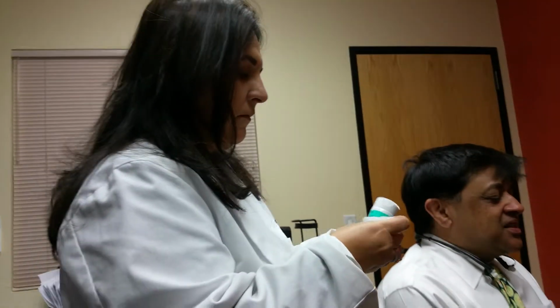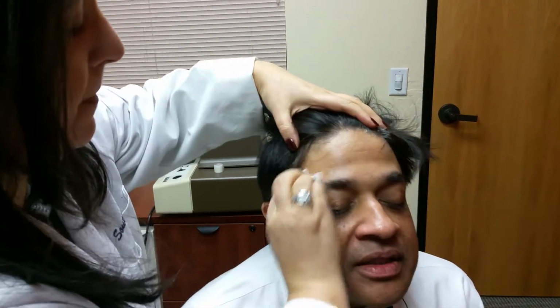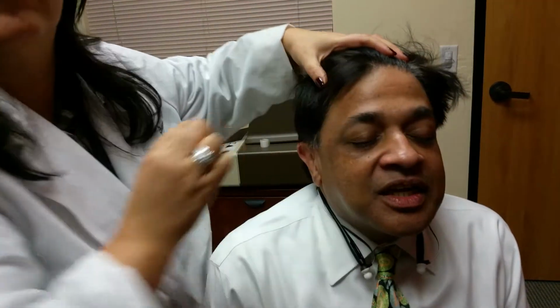Okay, back to VEP prep, and feel free to use all the angles that I was using. You can come in there and use your camera to get close-ups. And I am now in the patient and director role. And don't be afraid to really press, because you're not going to hurt him.